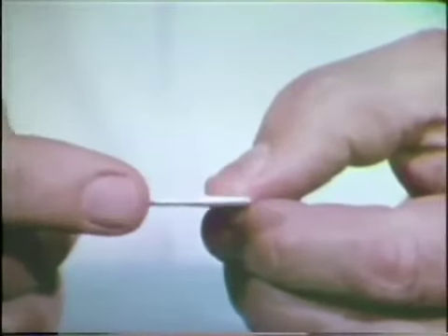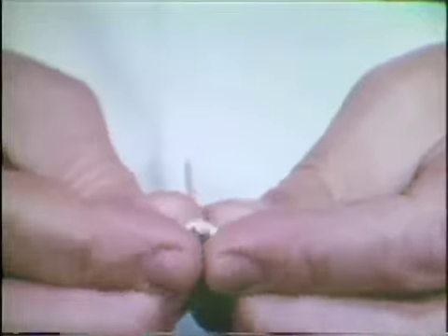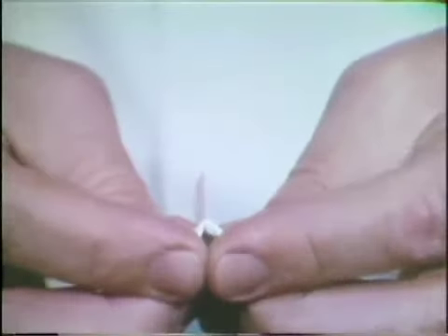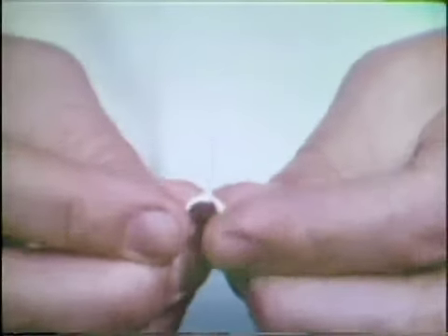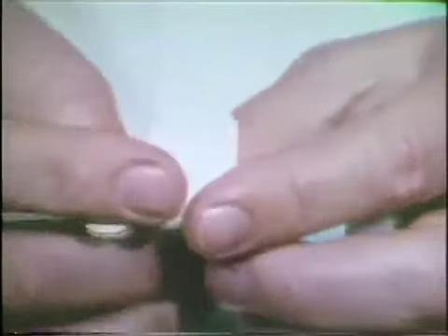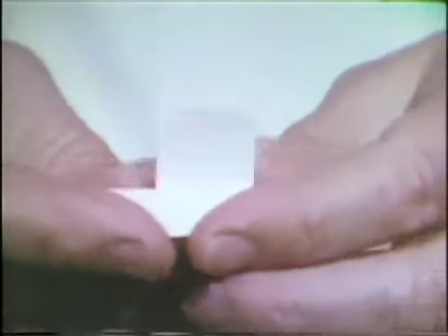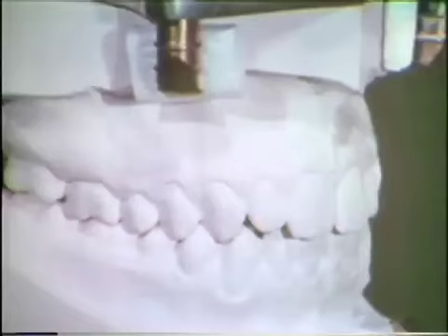The number 3 packet is generally acceptable. Since the packet is flat, the corners may be uncomfortable to the patient, and should be rolled back. This must be done carefully to avoid creasing the film. With the tab side up, the packet may also be rolled lengthwise over a finger to further facilitate patient comfort. Proper insertion and positioning of the film is all important, so we use models to demonstrate.